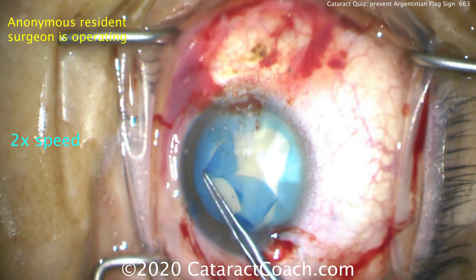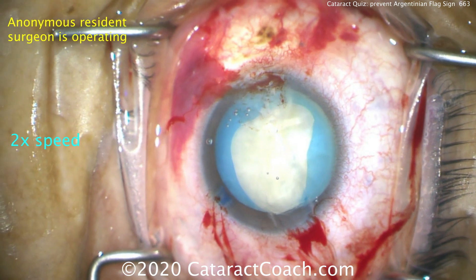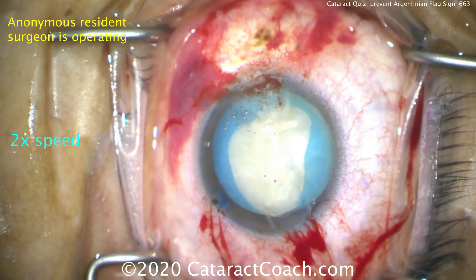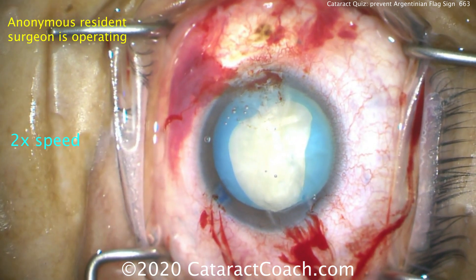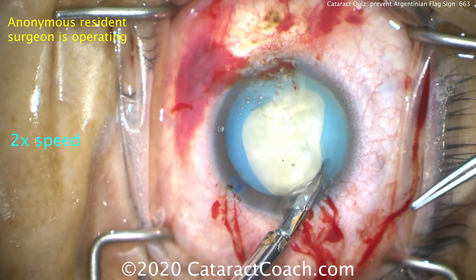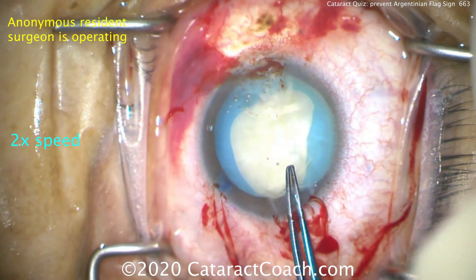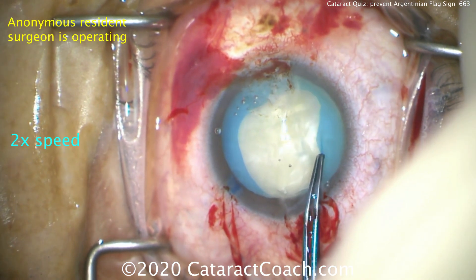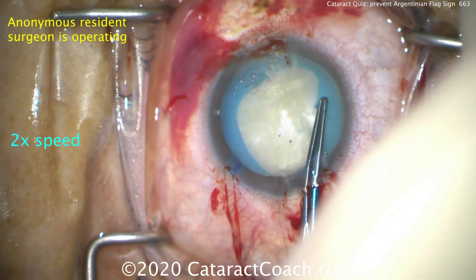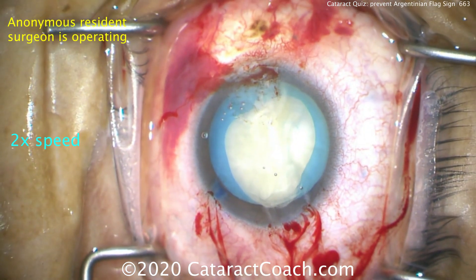There you go — pull it centrally, centrally. That looks pretty reasonable and should be okay. Let me see if we can help this resident. Let's carve this out just a little bit more. Now that it's intact and circular enough — it's continuous — make a little nick in there and we can clean this up and have a little bit better access. There you go. Now you can continue the case.